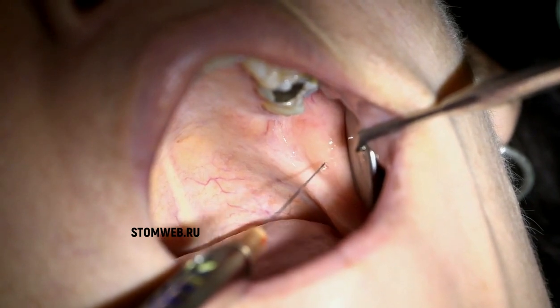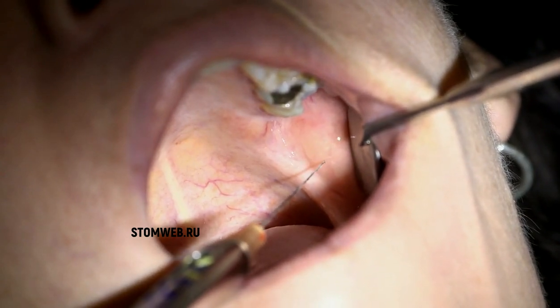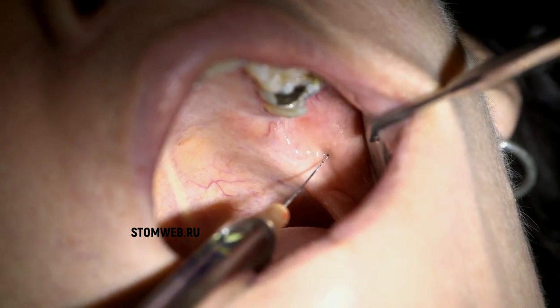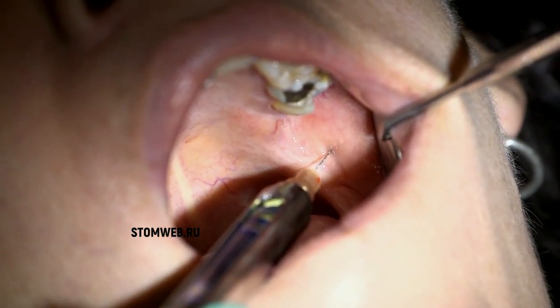The height is determined by the coronoid notch, the deepest point of the raphe, and is usually 10 millimeters above the occlusal plane. Insert the needle 20 to 25 millimeters, usually 2/3 to 3/4 of a long needle. There should be no resistance until you gently contact bone.